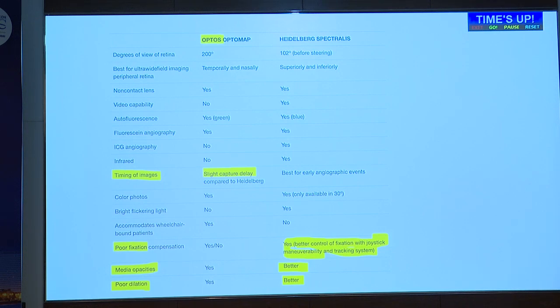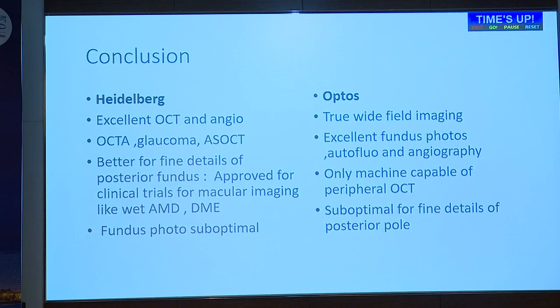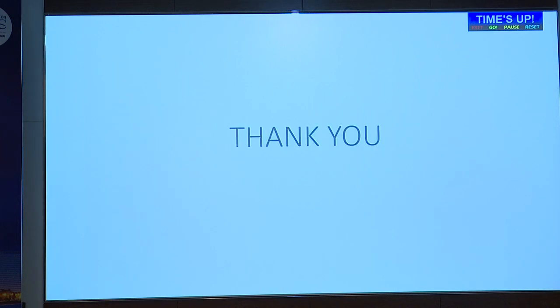But with the Spectralis, if you use your machine wisely, you can get all the same information as with the Optos. So in conclusion, both machines are excellent. You have to learn to do with what you have. This machine has this advantage and this machine has that advantage. Some drawbacks and advantages are there. So you have to decide which you want to go for. Both machines are excellent. Thank you.